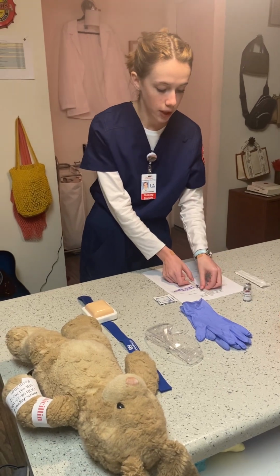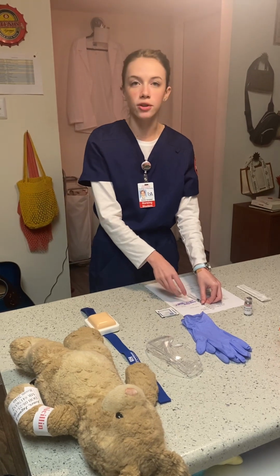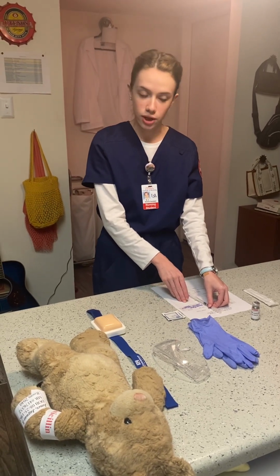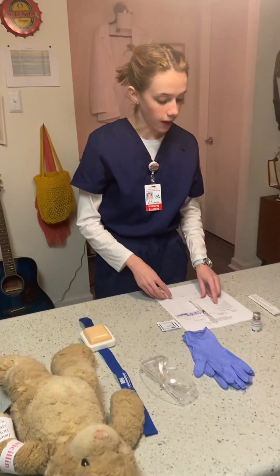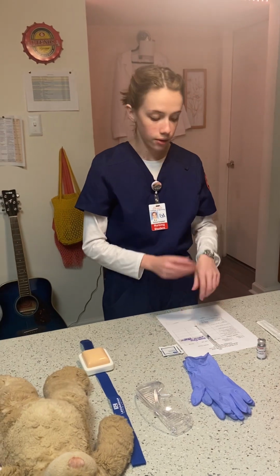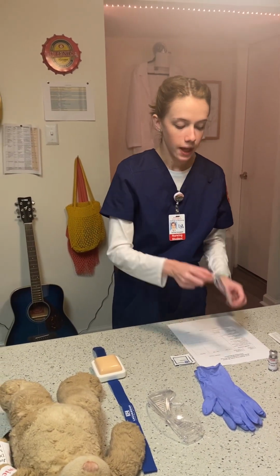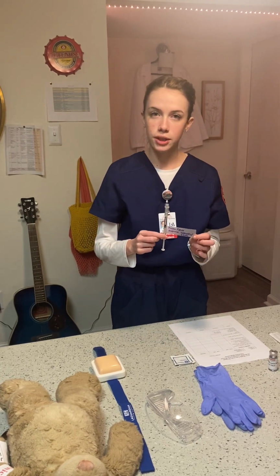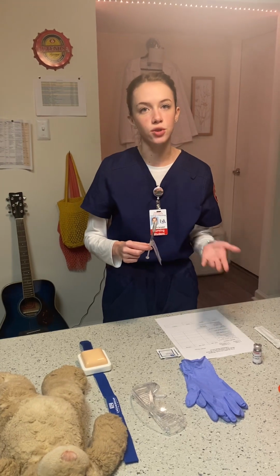When verifying the correct patient, I also want to make sure that I've got the correct name on the label of the medication administered as well. And after that, I want to verify that I have the correct time, every 12 hours. It has been 12 hours. We've got the right route, which is subcutaneously, and that's why we've got our TB syringe here with a 28 gauge half-inch needle, even though we would typically use a 25 to 27 gauge needle.